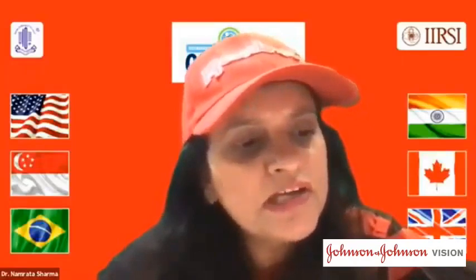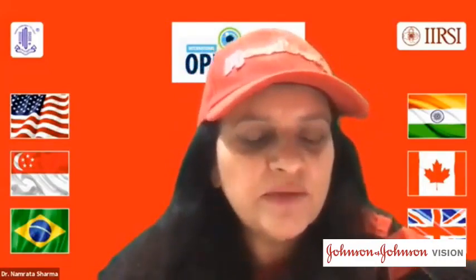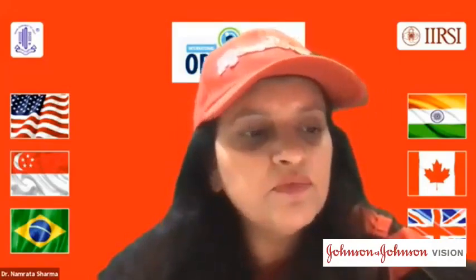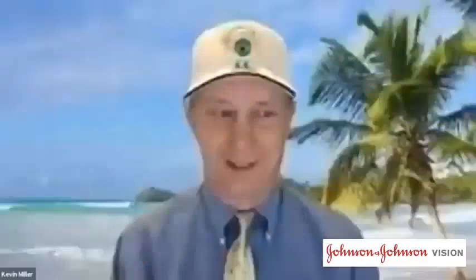Dr. Chintan Dholakia wants to know what should I do when the flap stops fluttering? Dr. Rohit Om Prakash showed very well that the flap motility sign is a good sign. But when the flap stops fluttering, what should I do? And can I stain a fluttering flap with the trypan blue dye? Dr. Kevin Miller?